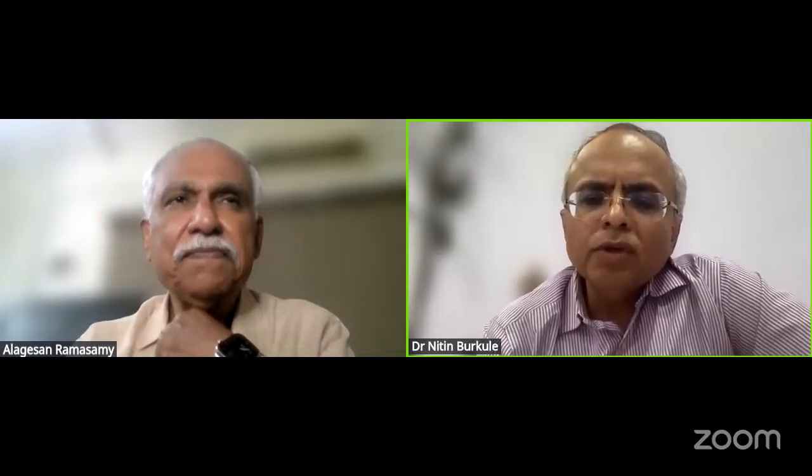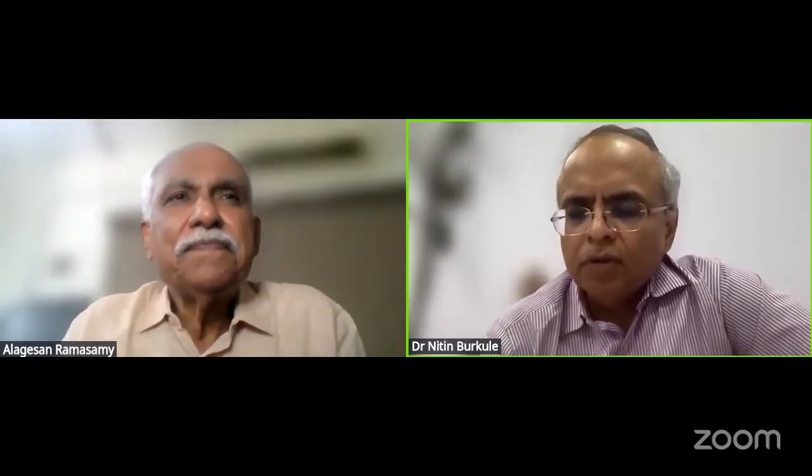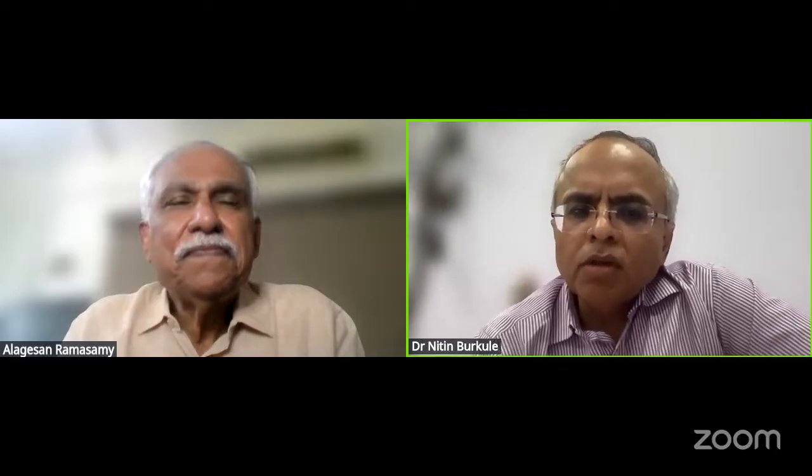Yeah. Then there is this question about the dynamic LVOT obstruction. Now, as we know, it is very labile; sometimes you may have a very minimal gradient, sometimes a significant gradient in various physiological situations. So the question is, should we be doing the Valsalva maneuver in all patients of hypertrophic cardiomyopathy? And if yes, how do we actually do the Valsalva on the patient while doing the echocardiography? I think that will be a very good teaching point, or tips for the people who have started doing echoes in HCM.